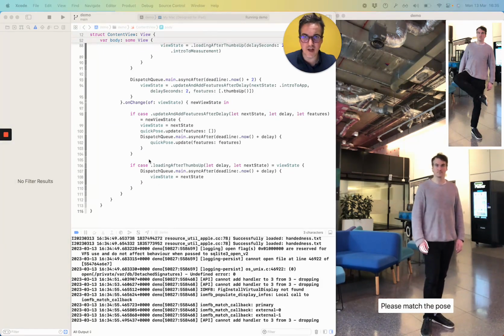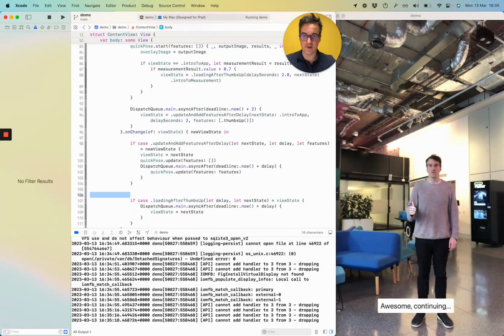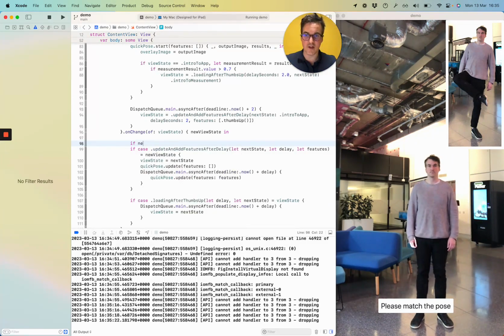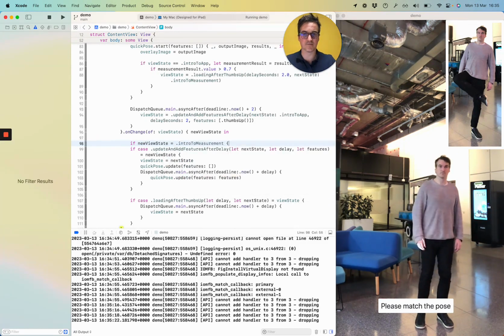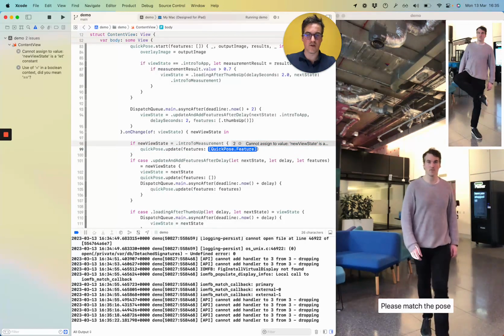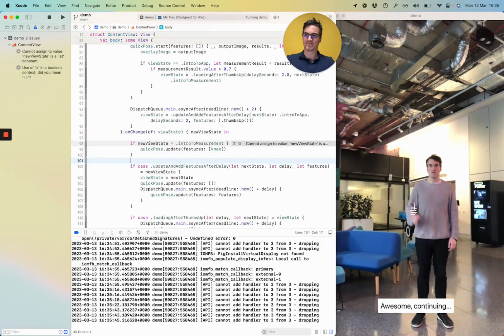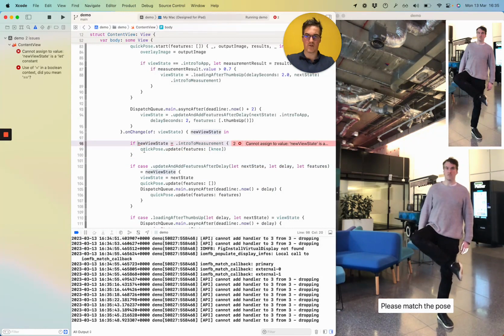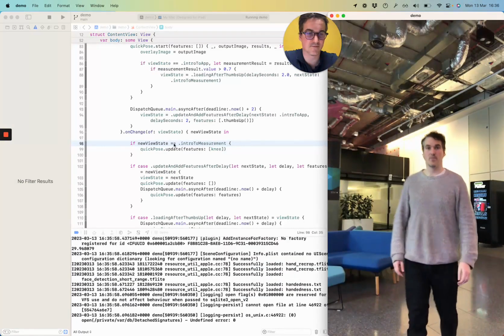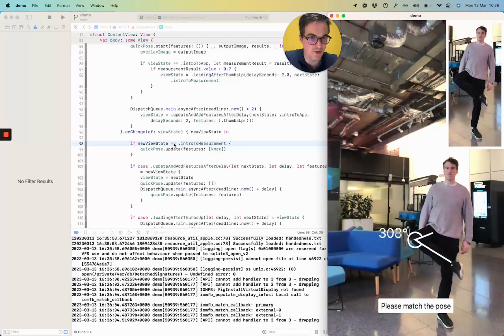So I think now the best time of doing it is no longer inside here after the thumbs up. We want it down here as part of our change of view state. So after intro to measurement, so if new view state equals intro to measurement, then we want to update the pose, update features with our knee detector. All right, there we go. You see how the thumbs up disappeared quite quickly. I'm very happy with that.